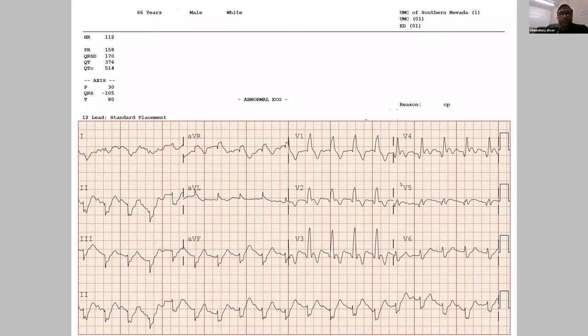Anyone? So if you look at the lower panel, because lead 2, I go to lead 2, is very good to know whether there is any rhythm issue. Looks like sinus tach, probably safe to say sinus tach. Maybe there is a right bundle and anything else? Look at the axis. Yeah, left anterior fascicular block there. Yeah.